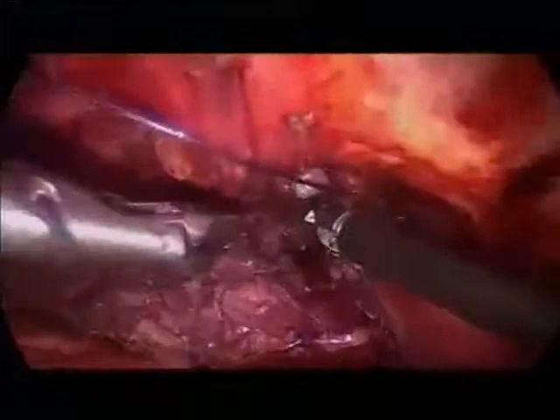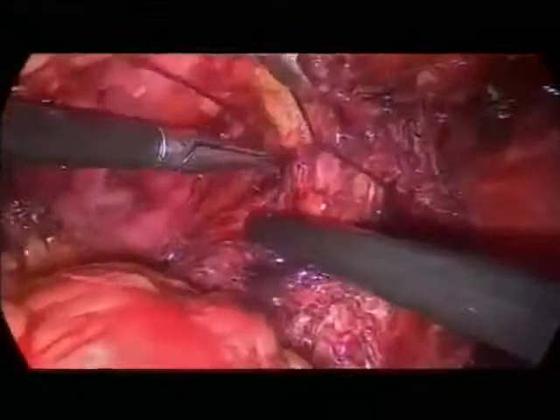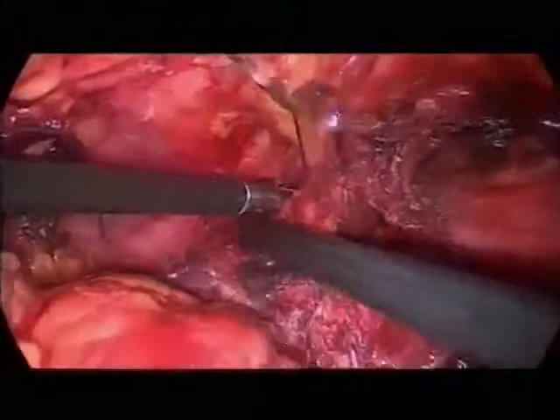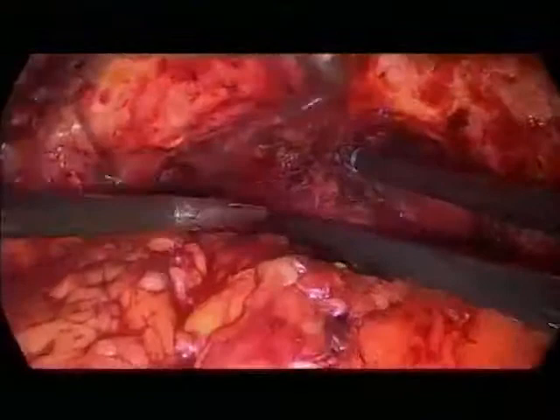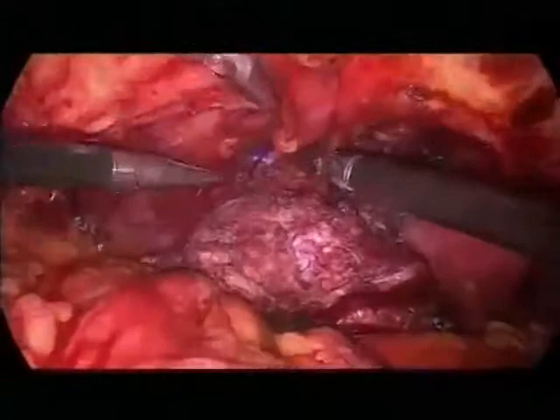Go back. So the assistant pushes the prostate towards the head to place the suture as cranially as possible. Okay, take it. Go back. So up to now, the blood loss is, let's say, 20 cc. Okay, leave it. And we do a second loop.